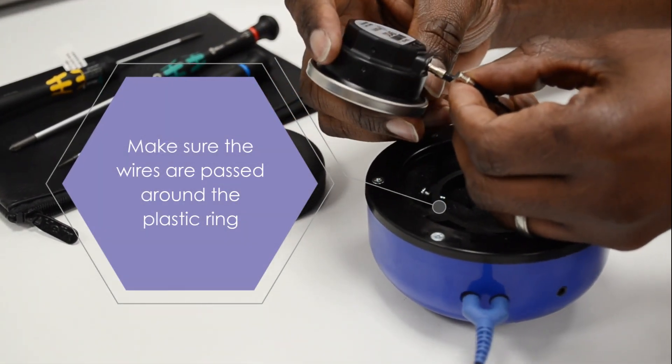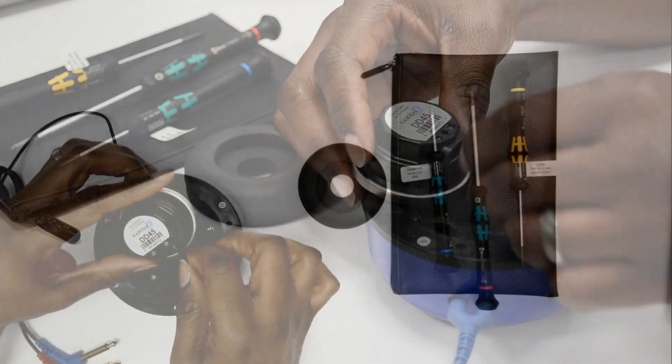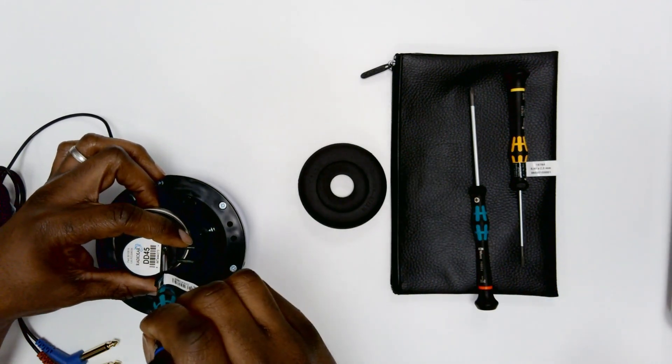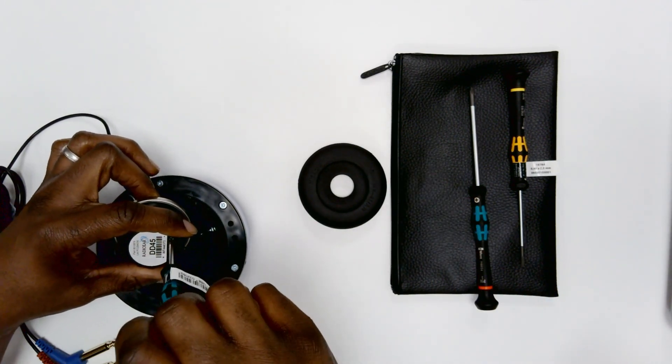Now look inside the audio cup, bring the two internal wires through the support ring and insert them into the earphone socket and tighten. It is important to make this connection first.